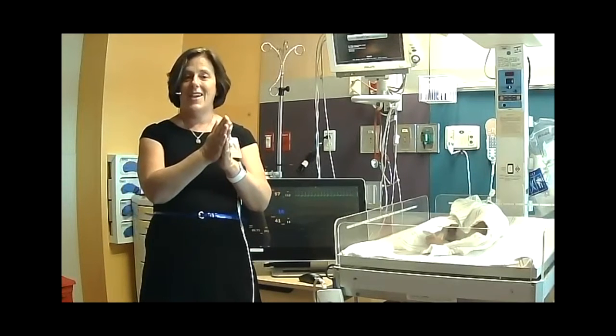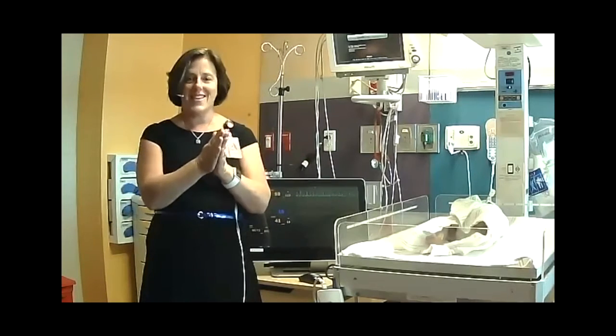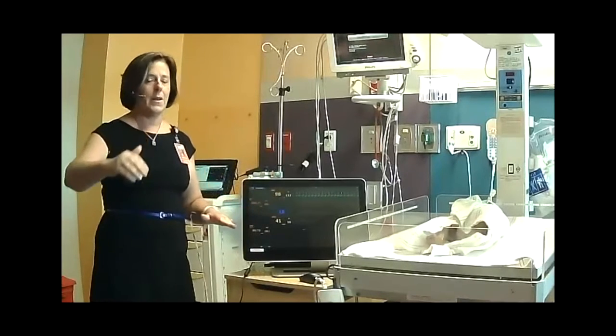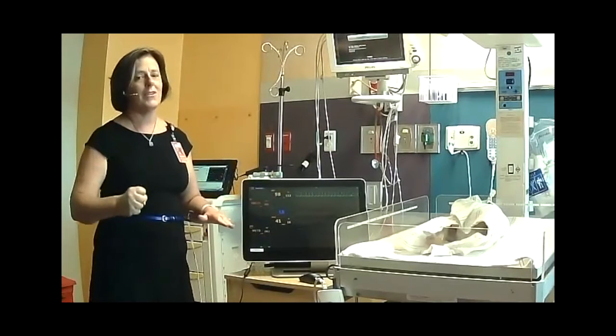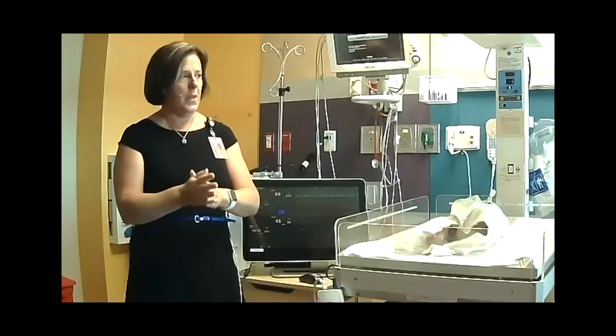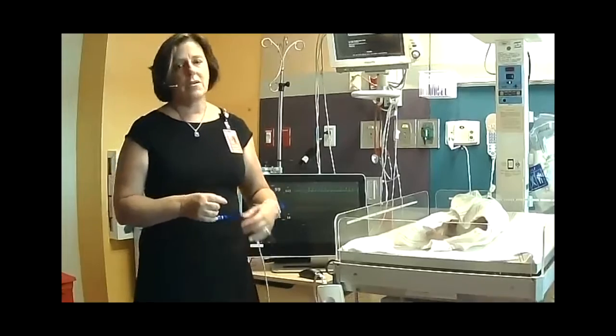a tighter edge, okay? A tighter edge that they can fall off because their body's doing everything it can. So another thing we'll look at is pulse oximetry, how much is going out, right? How much the heart is pumping every squeeze to send out. And as I say, you think of red cells, you think of little trucks, right? Delivering oxygen. All right. Then the other side is something we call NIRS, INVOS, whatever you want to call it.